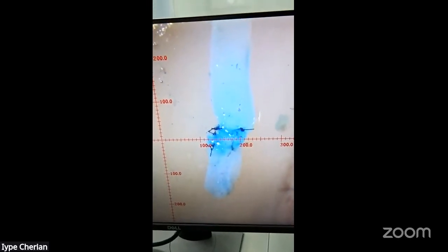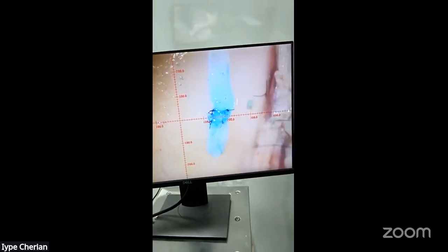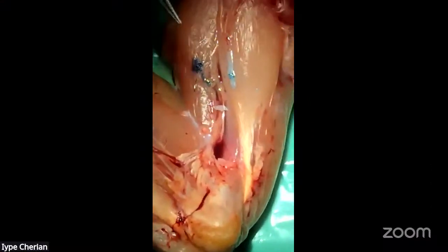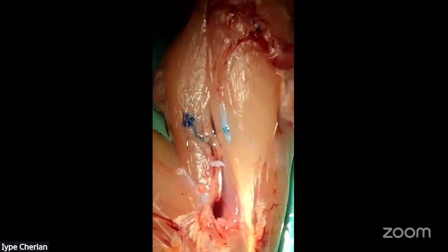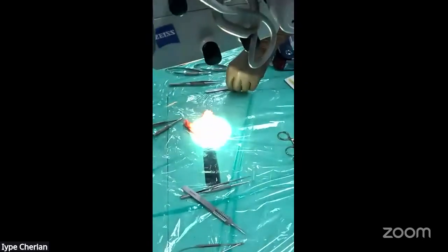This will give an overview of things. This is an anastomosis workshop, and you can see how thin, how small that vessel is when you come here. Can you see the patch now? Yes. This is the patch. That's a patch. So small.